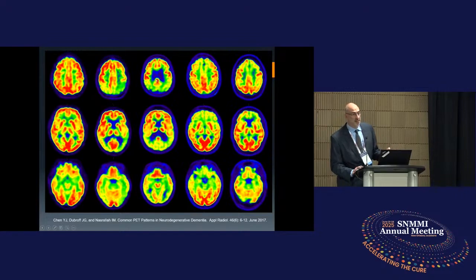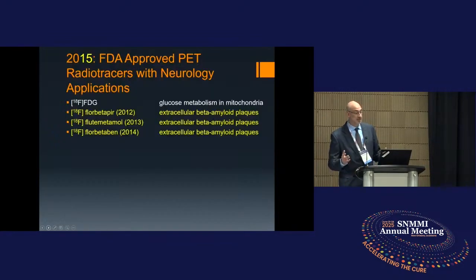This is what we call the Lewy body dementia pattern. And in these two, you see the decrease in the front part of the brain. This is the horizontal axis in the brain. There's less metabolism, and that's more of a frontotemporal dementia. All these can occur. So what's been happening with radiotracers? This was our only tool, and it was a very helpful tool, and it continues to be a very helpful tool for neurologists and geriatric psychiatrists and people who diagnose memory disorders.